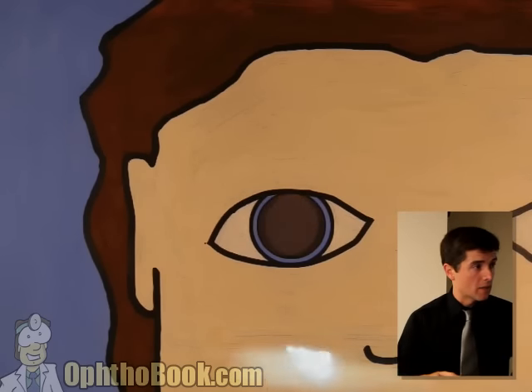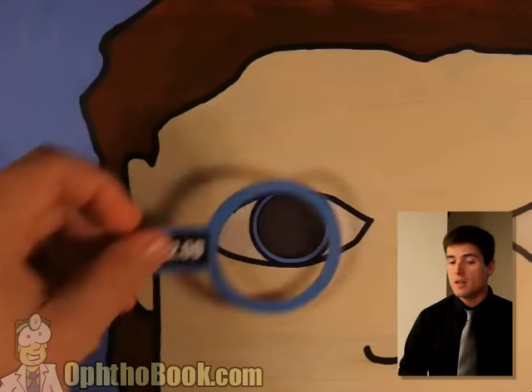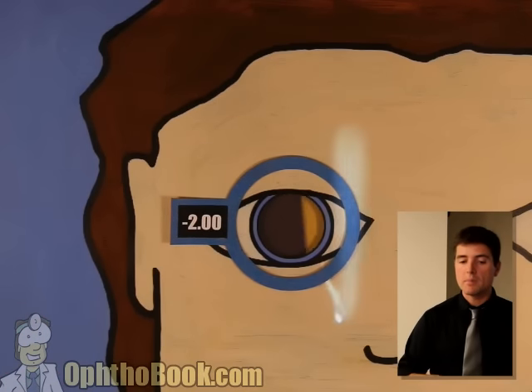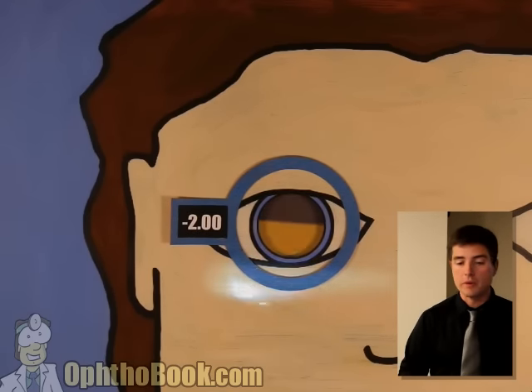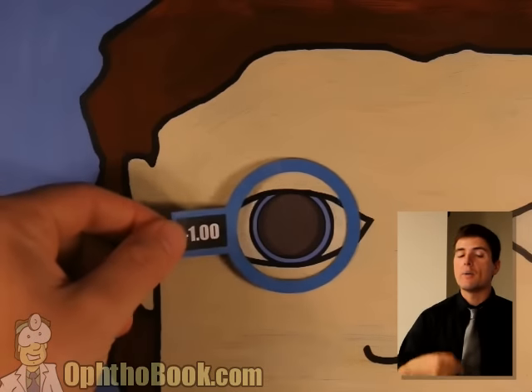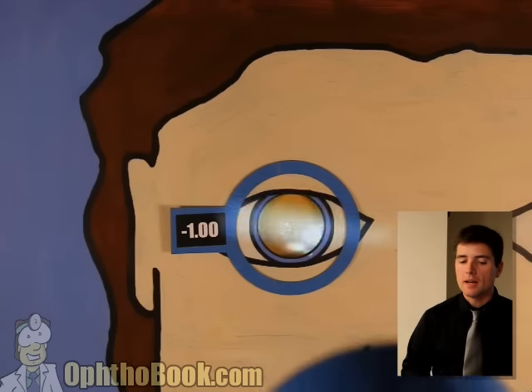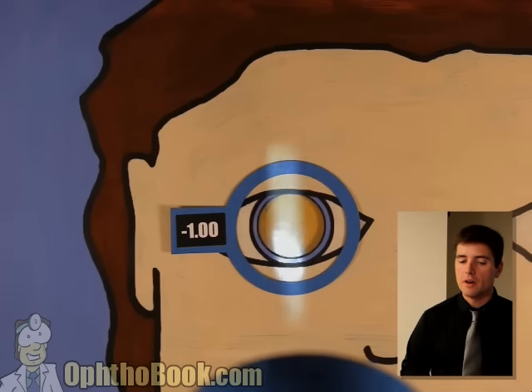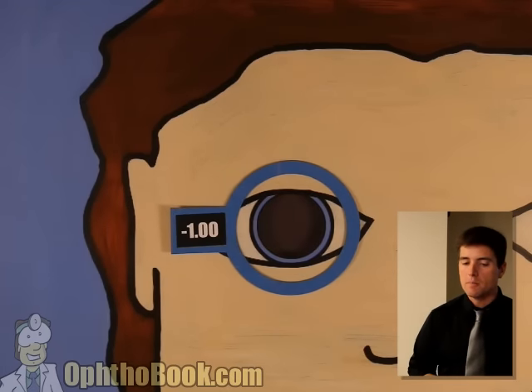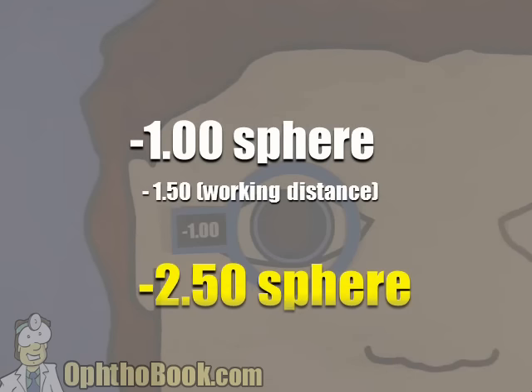We've got against motion right from the start — uh oh. Remember, step one is you have to start with with motion. If you have against right from the offset, you back off. Start with a minus two, minus four, or whatever it takes to start with with motion. We went back to minus two — good. Now we can add power. We go to minus one — looks like we've hit the perfect prescription. Check the other axis — fine. Our answer is minus one. Subtract your working distance — you end up with a minus two fifty sphere.